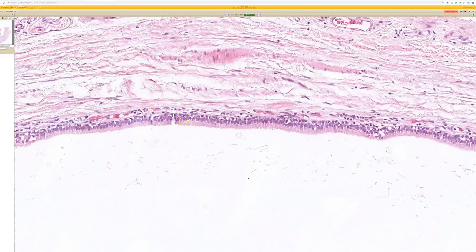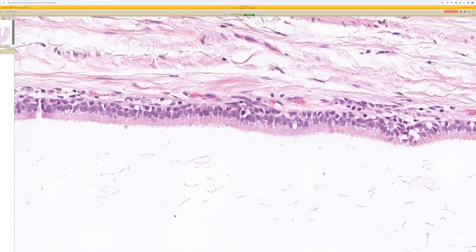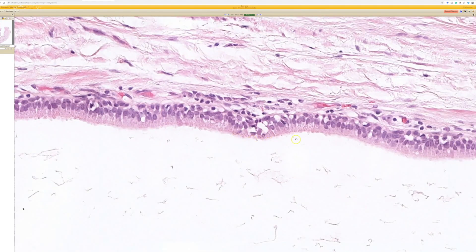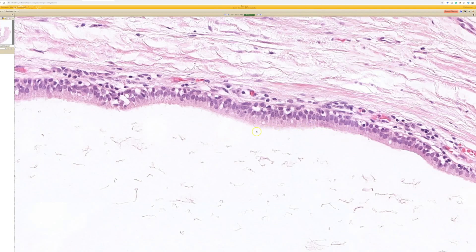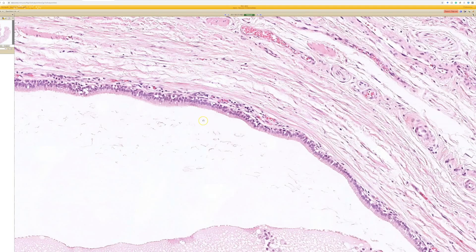We've got a nice columnar lining here — there's a simple cuboidal basal layer and then a nice single layer of columnar cells. In this case you could almost wonder if they've got apocrine snouts or cilia; it's really hard to tell, but I think it's probably more like apocrine snouts. This columnar lining can sometimes be pseudostratified columnar, but it can also be more squamoid or have other types of lining — it really varies.